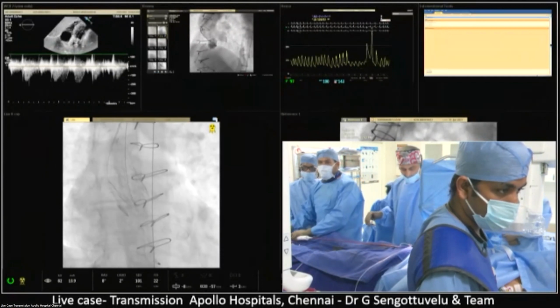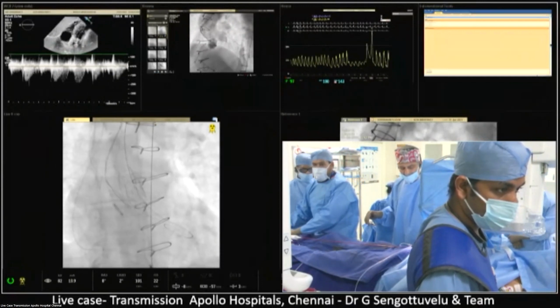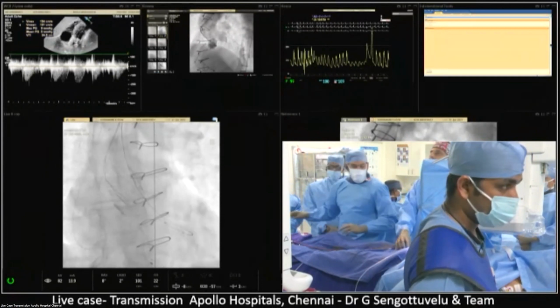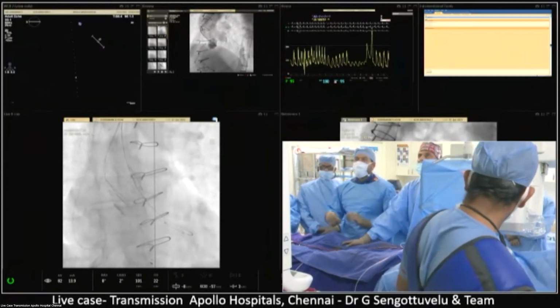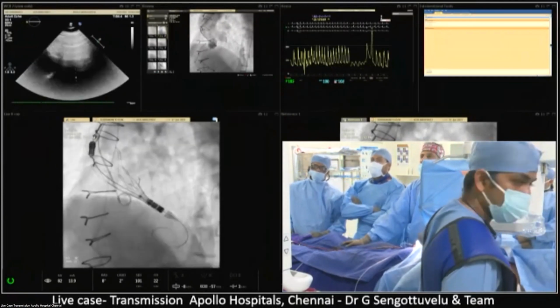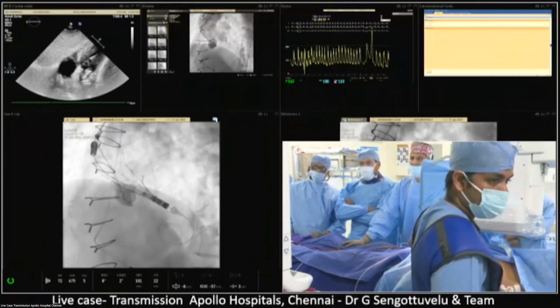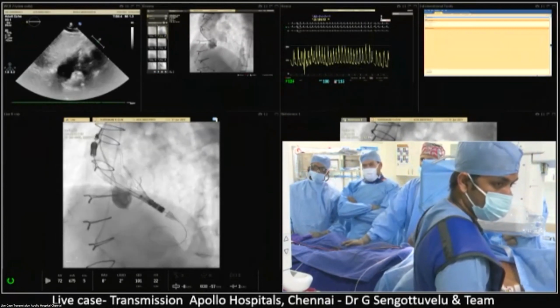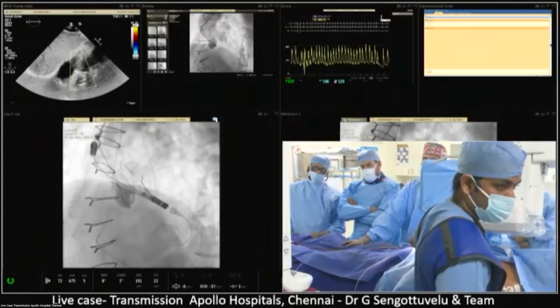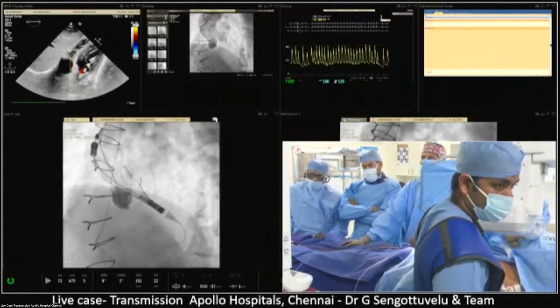So what happened was the wire, we couldn't take the valve out. The valve could not be taken out. So show the picture. So we had to deploy the wire position. That's the best thing we could do. But the problem, because of the wire, you see the valve is lifted up. We couldn't get the proper orientation of the marker with the pigtail.